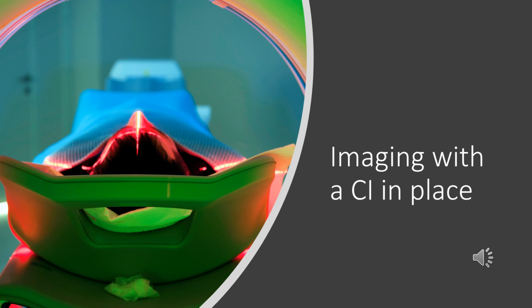Patients with cochlear implants may have to be imaged, and imaging depends on their pathology and where they are going to get their image, on the head and neck or in other parts of the body. The problem of the presence of the cochlear implant is due to the presence of the magnet and its metallic components.